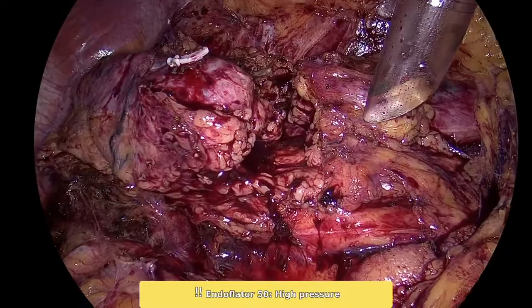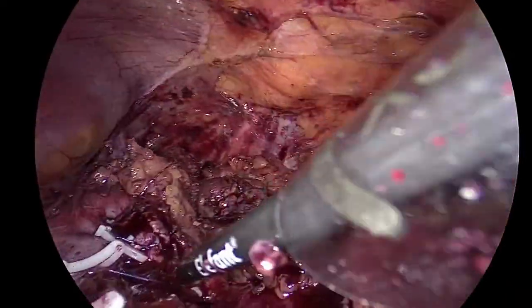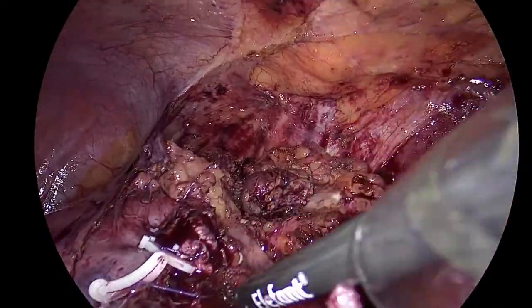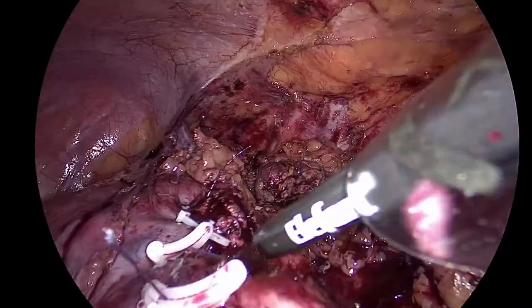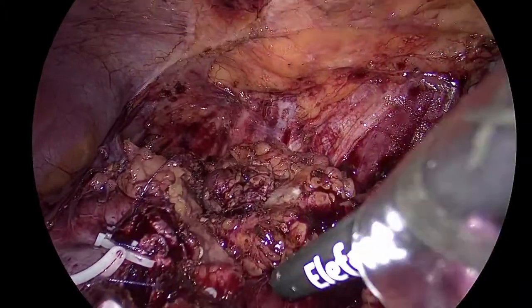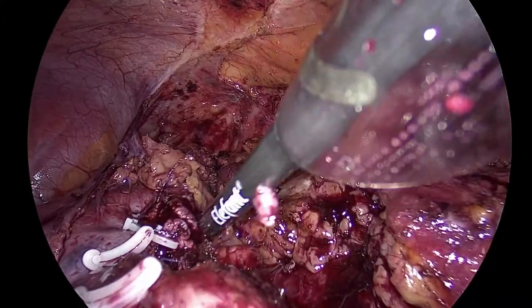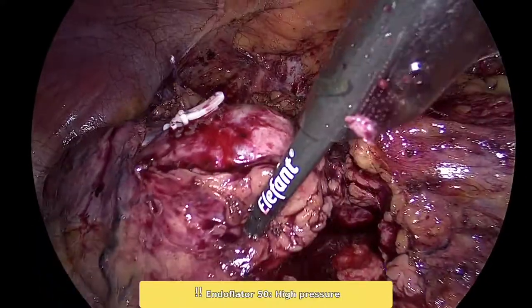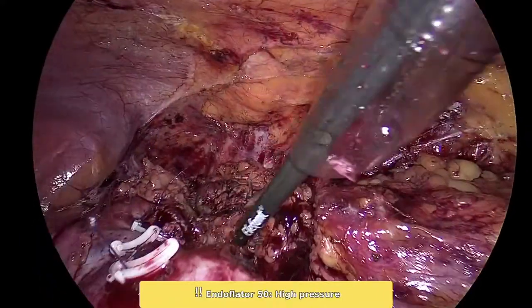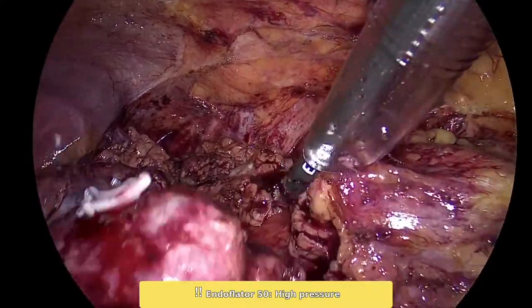Give me the grasper. Up here. Come in. What do you think? I think it's good. Bring the pressure down to 5, please. It's good. No bleeding. Give me the V-lock. I will take this and put it on the wall. Yeah. Give me the bag.